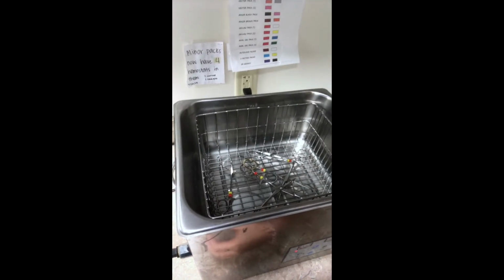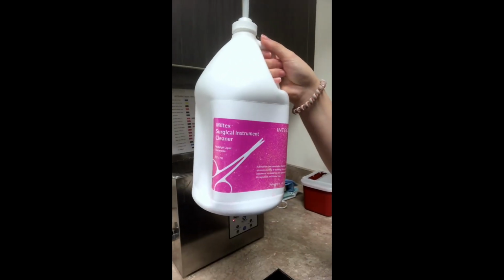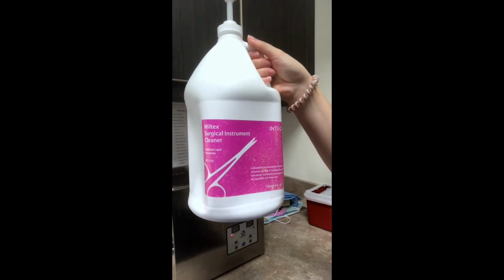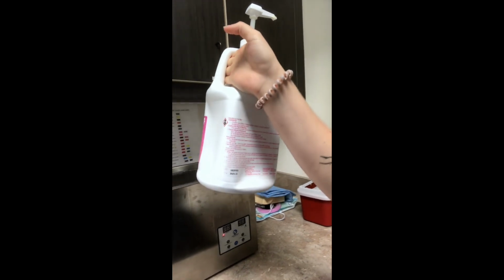And then once they are dry, we're going to come back and use the ultrasonic cleaner. So after we have cleaned our instruments, we're going to use the ultrasonic cleaner. We have a gallon of water in here, and our instruments, we're going to use 1 pump of our instrument cleaner. It says it can be used for ultrasonic cleaning and manual cleaning.